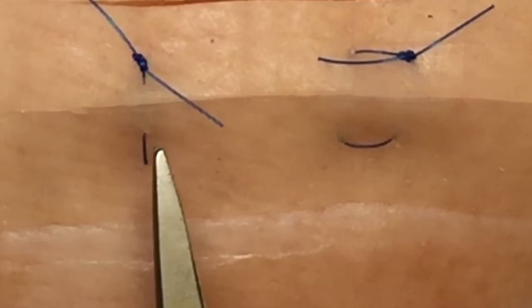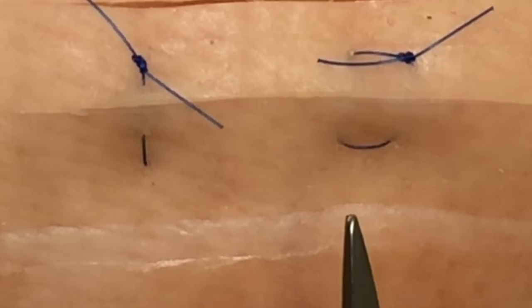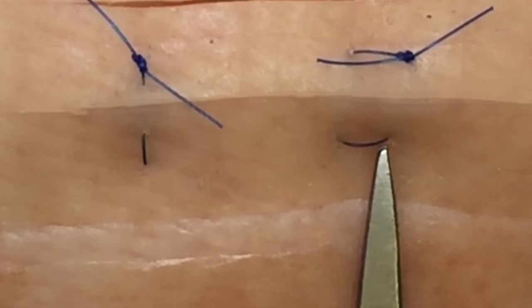Here we have two mattress sutures, one vertical and one horizontal. When removing mattress sutures, it doesn't matter whether you are dealing with a vertical or horizontal suture.